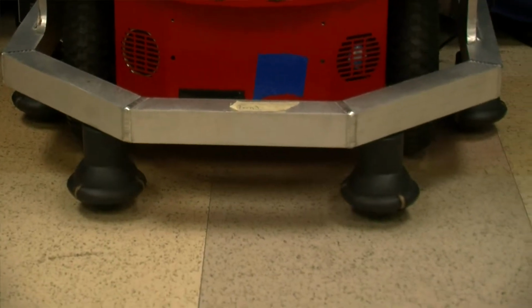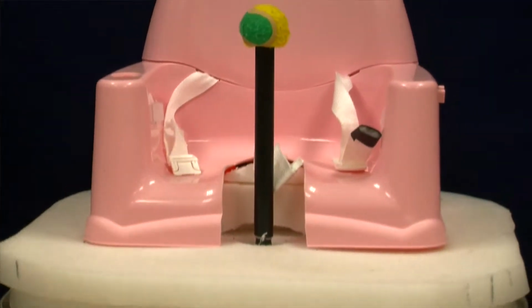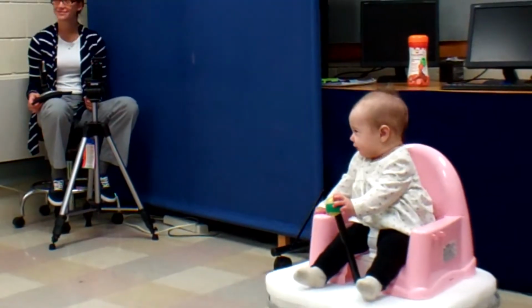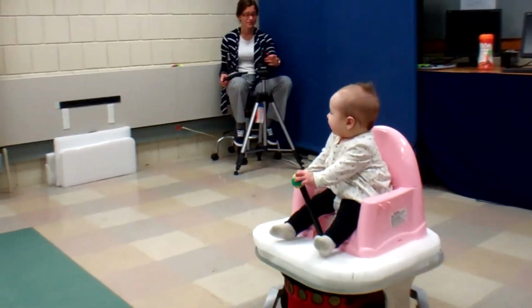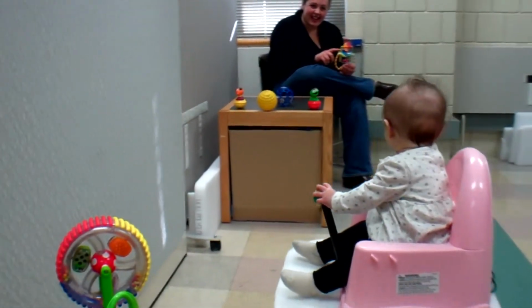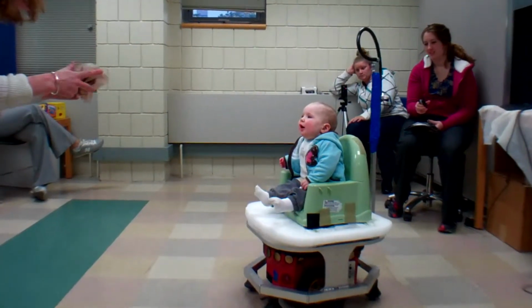I was interested in providing mobility to infants with disabilities who are unable to use a powered wheelchair. These are usually used by adults, and they are generally used with a joystick. The joystick is adapted so that it's easy for babies to use, I think easier than the traditional joysticks on a wheelchair. It has sensors on it, so the baby cannot run into a wall because it has sonar, and the sonar says there's something in your way, and we just have the robot stop. So the baby can't move forward if it's going to run into a wall.